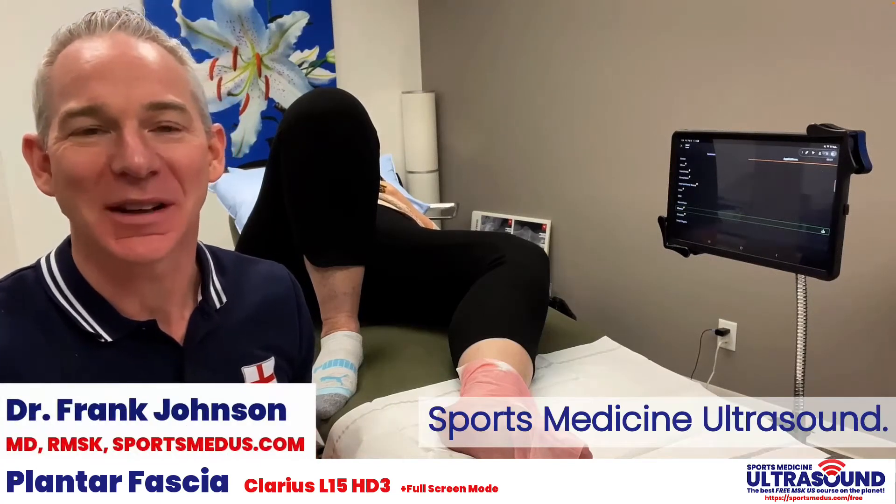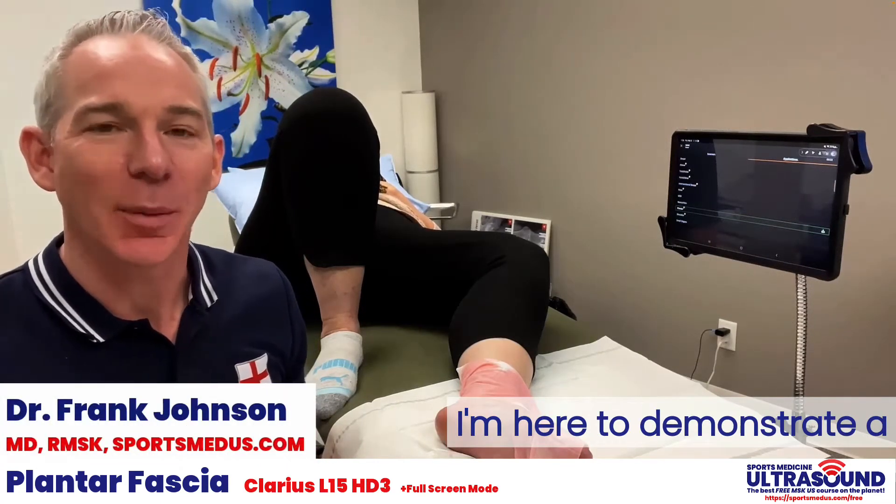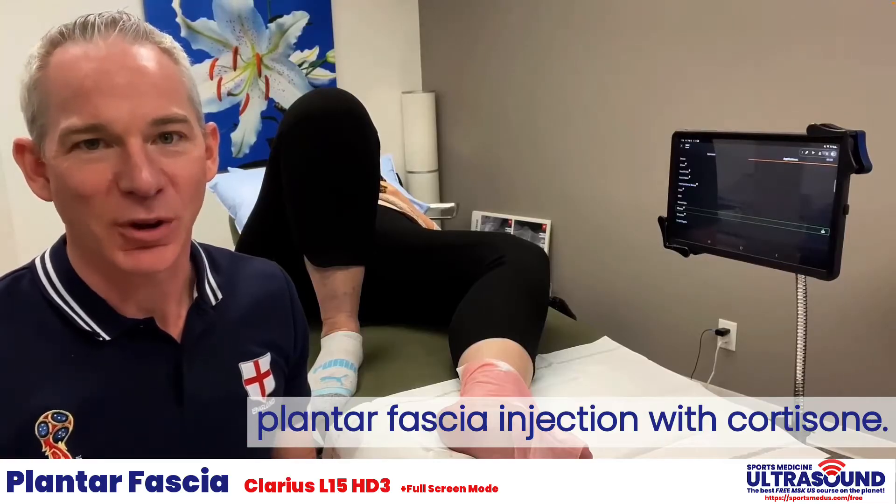Hi, Dr. Frank Johnson from Sports Medicine Ultrasound. I'm here to demonstrate a plantar fascia injection with cortisone.